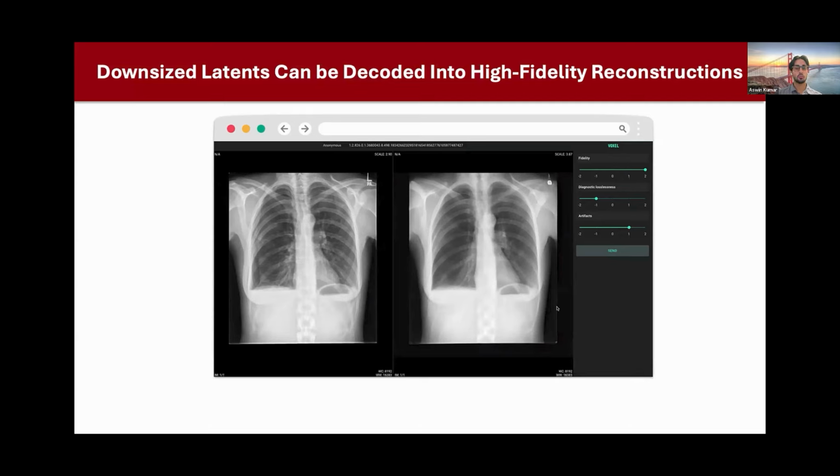But here we're going to show some results from a qualitative reader study, using domain experts to understand the clinical usability of our models. Each reader was presented with a pair of chest x-rays, as you can see here, consisting of the high resolution image on the left and the reconstructed image on the right. We saw a total of 50 unique chest x-rays with fractures. The reconstructed image was scored on a 5-point Likert scale, ranging from -2 to 2. And our study involved 3 radiologists as expert readers.